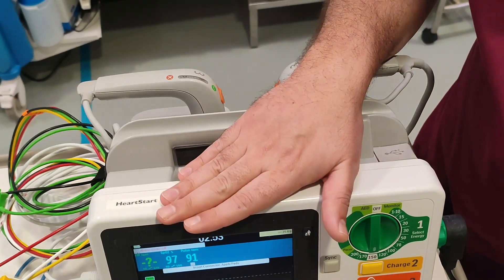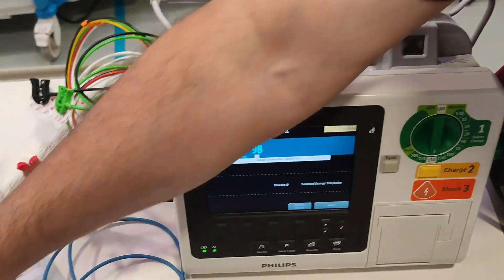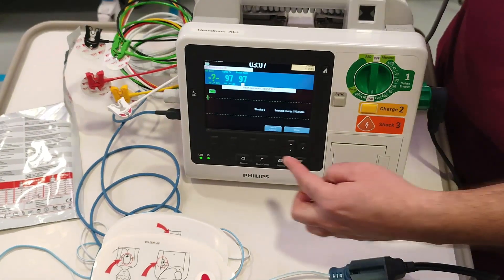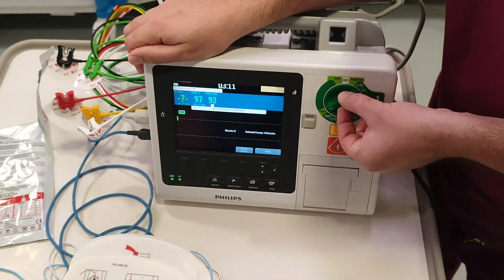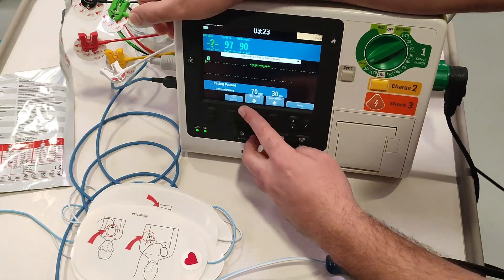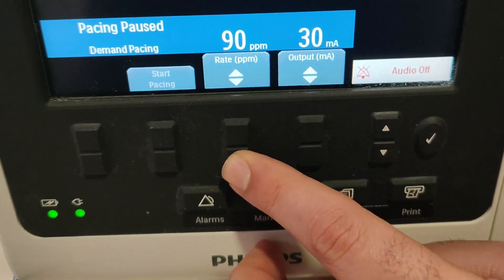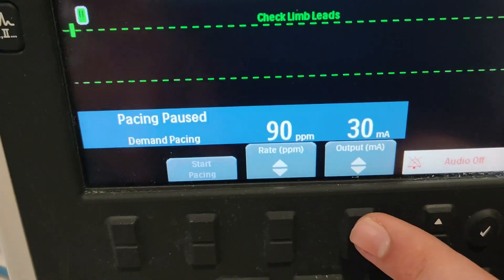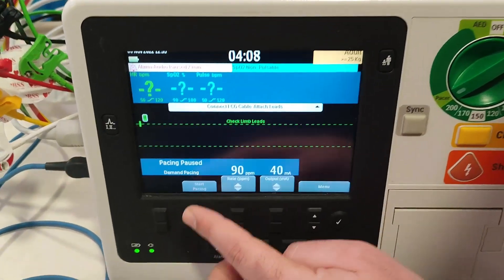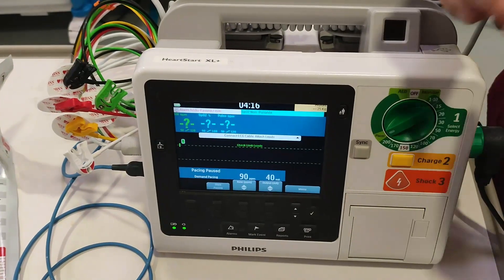This machine can also be used for external pacing. With these pads, you attach the ECG electrodes to the patient. On the ECG mode, change it to the pacer — here is the pacer mode. You can select the rate from here, for example 100 or 90 or whatever you need. Similarly, you can change the output from here. Once you are done, you can start pacing from here.